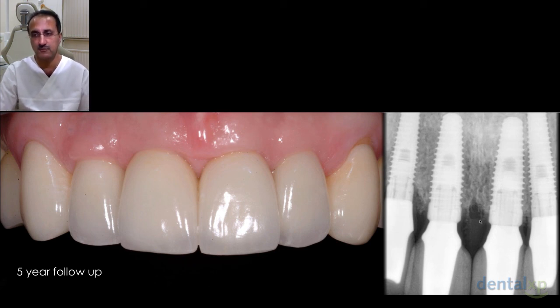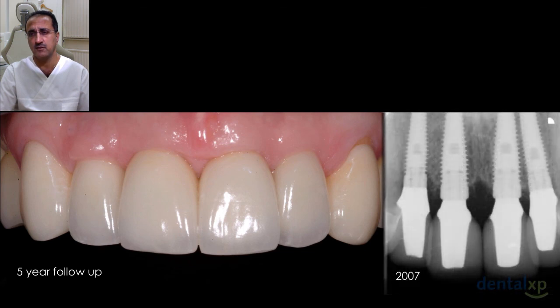And what's interesting is if you look at the radiograph on the right-hand side here, where my mouse is showing, at 5 years, you see some improvement in the bone around these implants. In fact, if we go back to 2007, when we fitted the prosthesis, you see a rather less mineralized looking bone architecture.